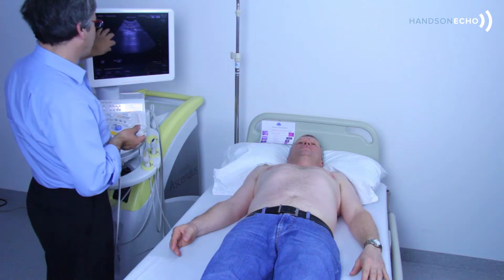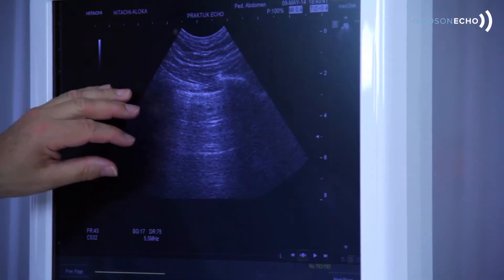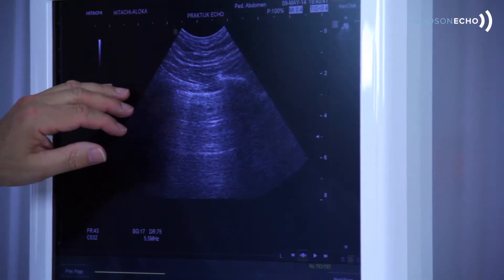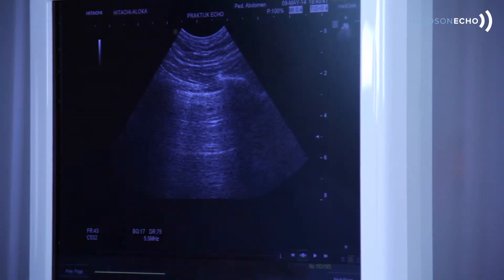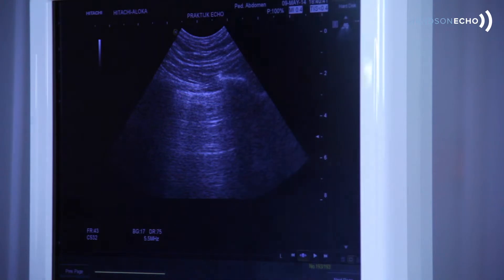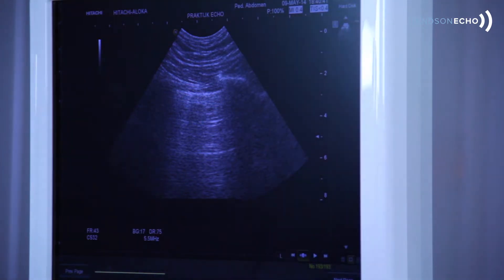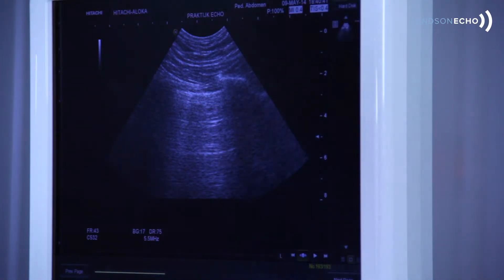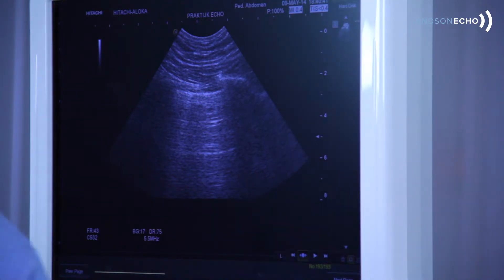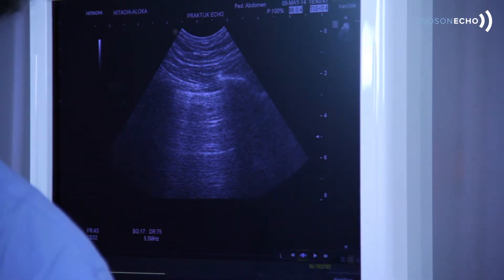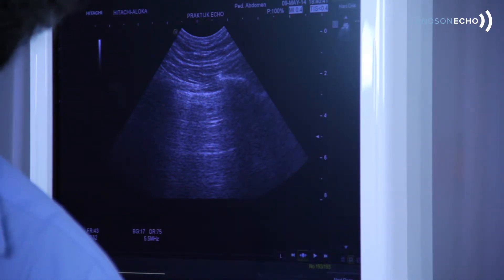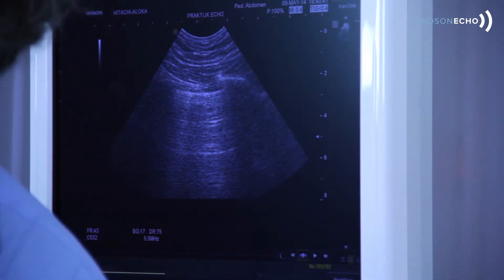A line with lung sliding is normal lung surface. This is at the anterior chest wall what we call the A profile. So A profile is expected in this gentleman who is completely healthy.